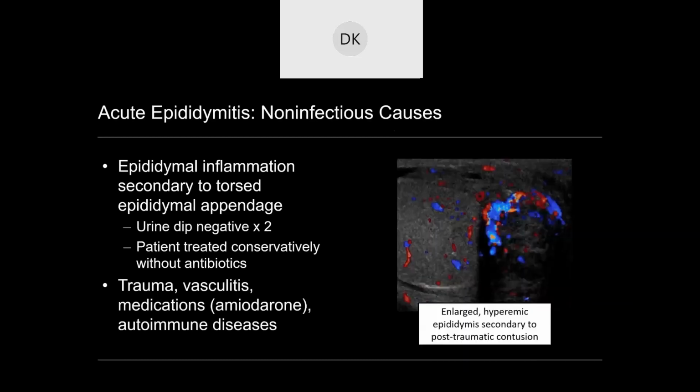This is a patient that had scrotal trauma, and you can see how that epididymis is enlarged and hyperemic due to a post-traumatic contusion. So an example of non-infectious acute epididymitis. All right, so the appearance of epididymitis should be quite familiar now. You can see here's another example.